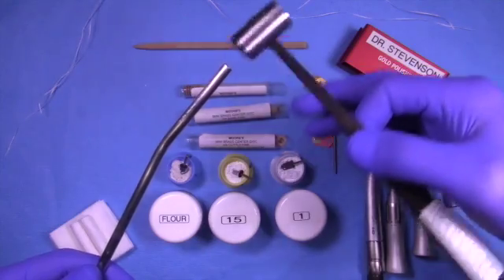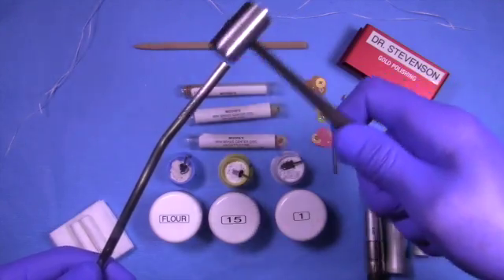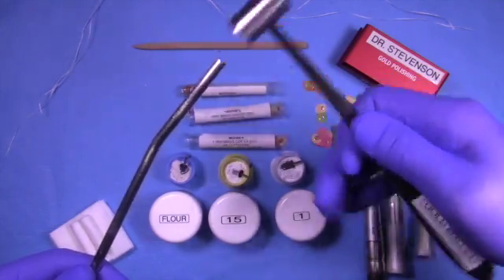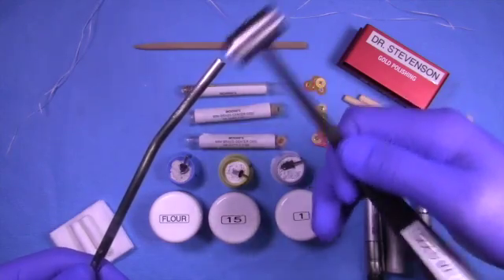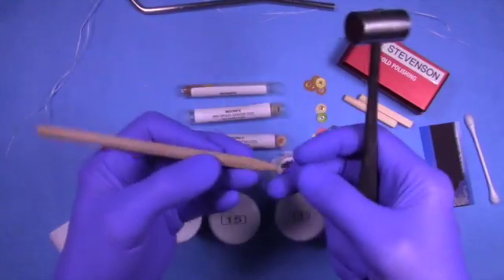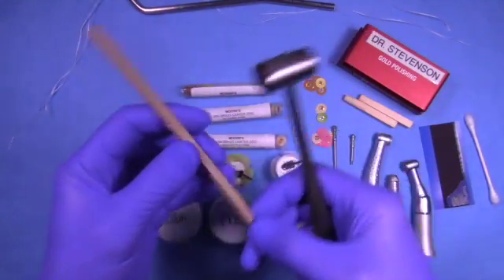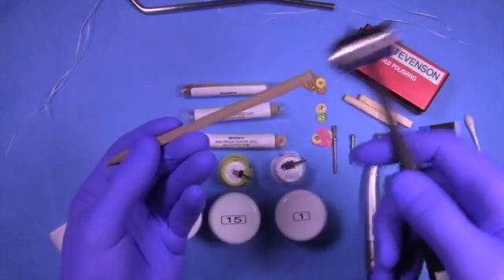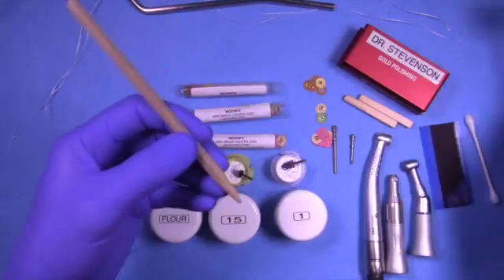We like to utilize a lot of pressure with our hand pushing in the inlay, and then a very light tapping mode, actually holding the mallet not like this but like this so you have a more gentle tapping motion. It's almost like a vibration.